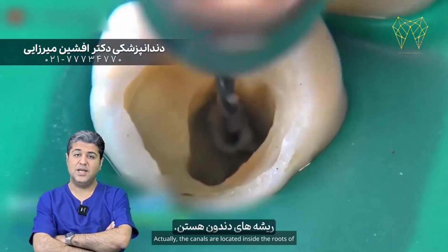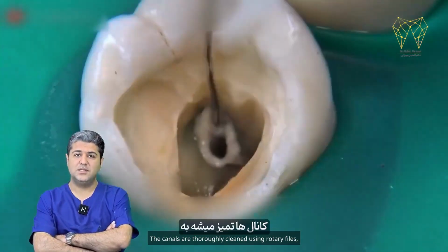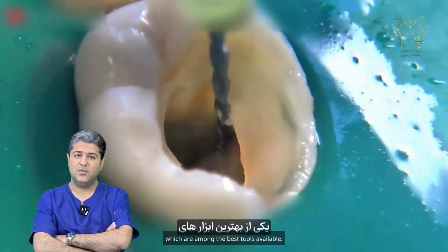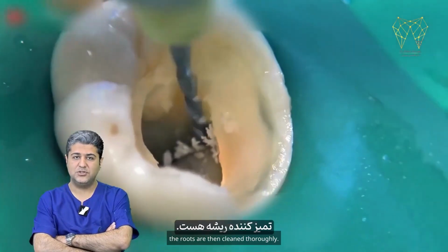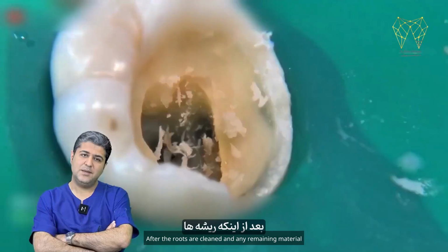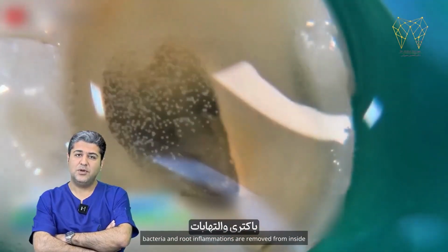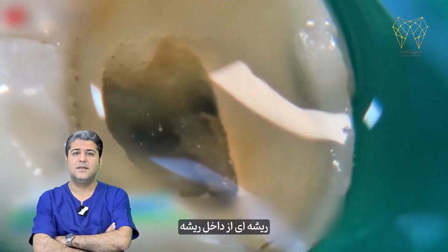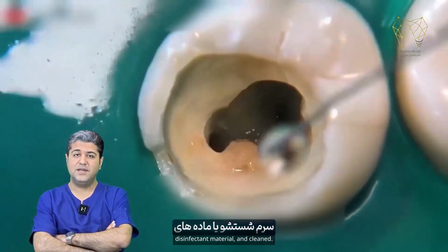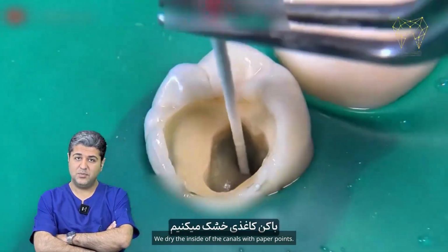Actually, the canals are located inside the roots of the tooth and they are carefully washed. The canals are thoroughly cleaned using rotary files, which are among the best tools available. These are root canal cleaners. The roots are then cleaned thoroughly. After the roots are cleaned and any remaining material is removed, the process continues. Bacteria and root inflammations are removed from inside the root and washed with a saline solution or disinfectant material and cleaned. We dry the inside of the canals with paper points.